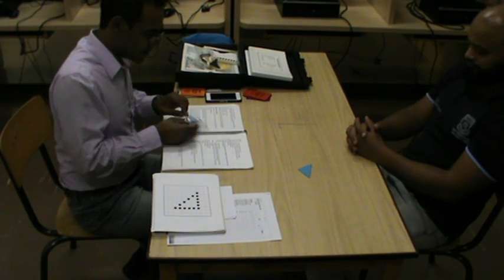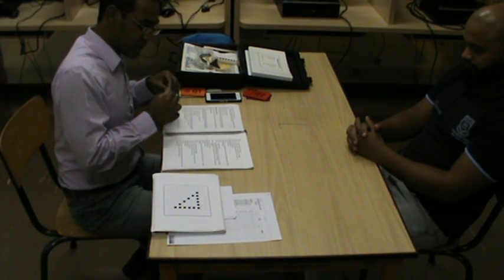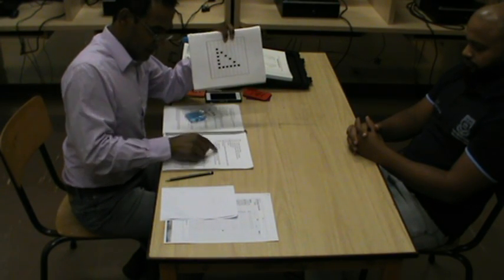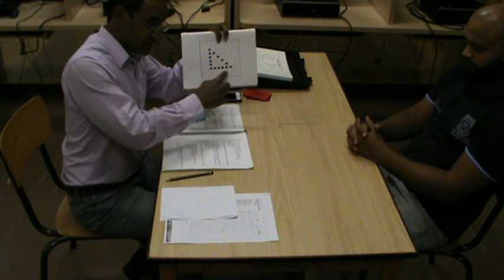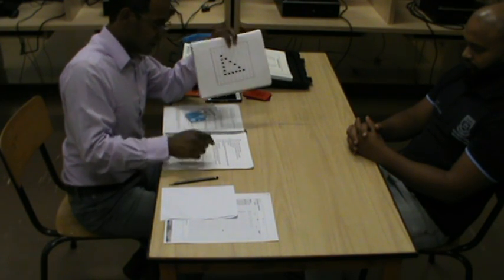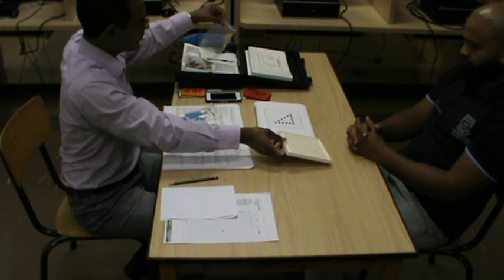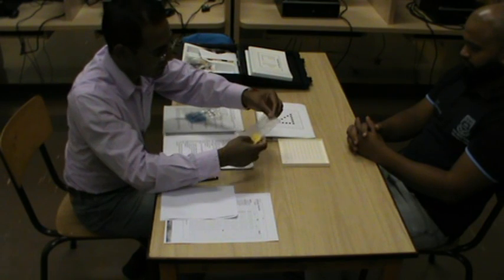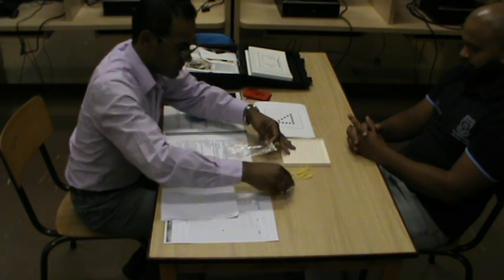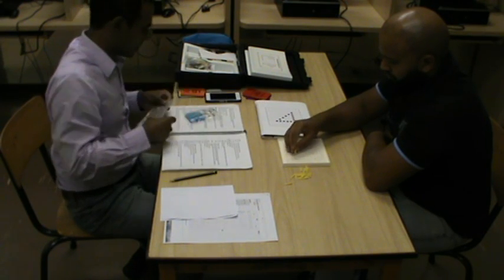The next aspect is the pegboard construction. So here the examiner puts in front of the client a pegboard, and it's on page 21 in the test booklet, and pegs, and the design of a triangle. The examiner gives the instruction, construct this pattern. And obviously this pattern is simulated in the pegboard. And here's your pegs. Construct the same pattern, position it in the same way. And it's over there.